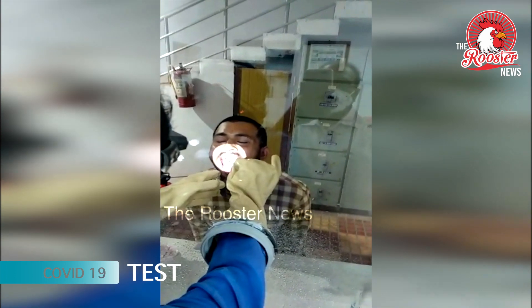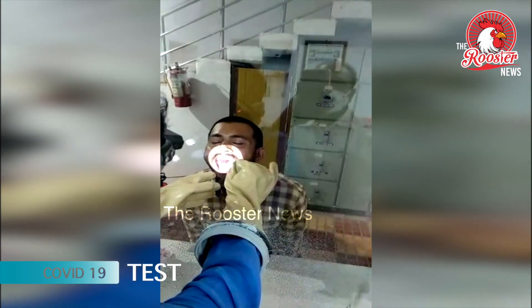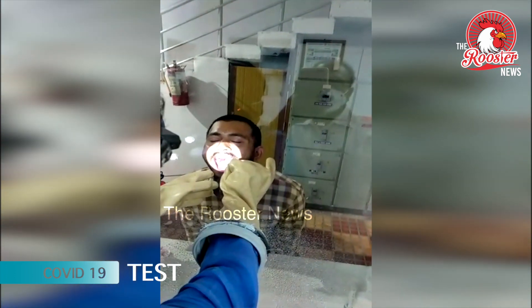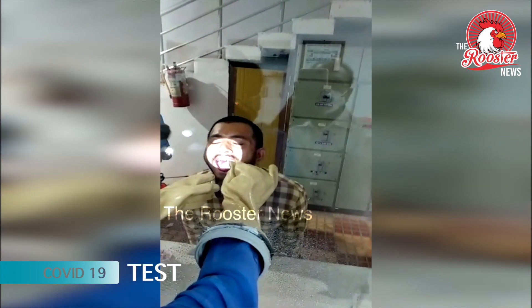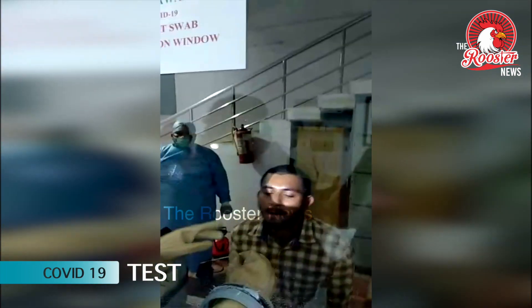That is the moment when the patient is prone to cough, and that's when the glass pane helps in protecting the doctor.